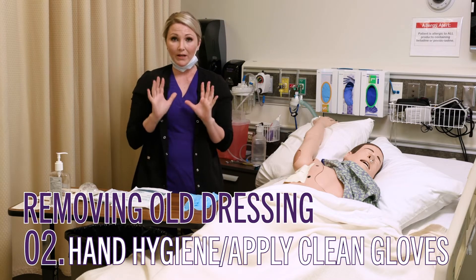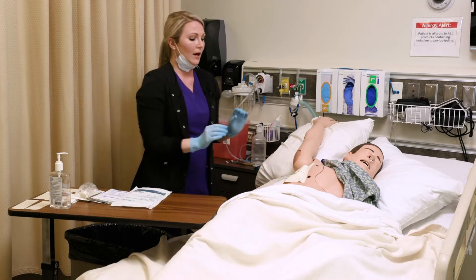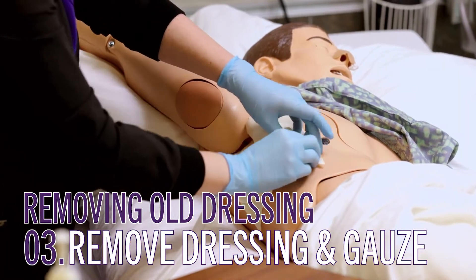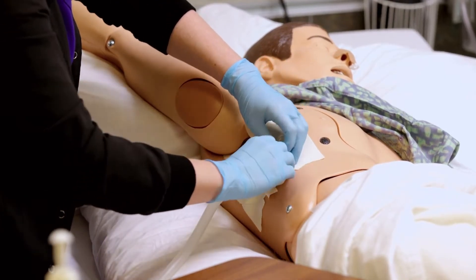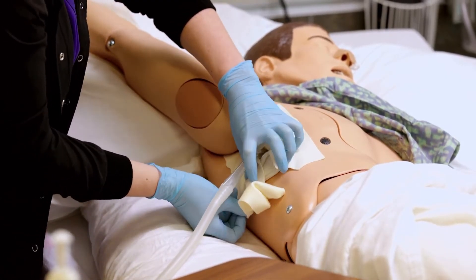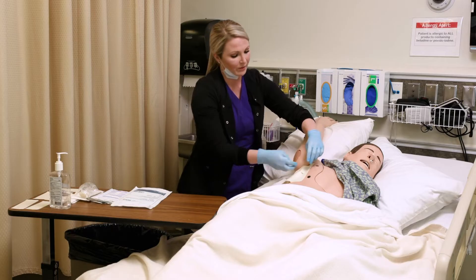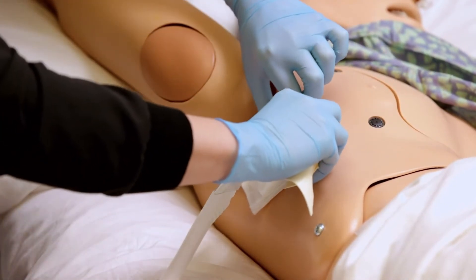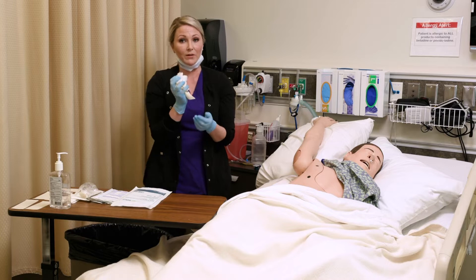I've already done hand hygiene. I'm going to apply clean gloves and then go ahead and remove the old dressing. I'm going to keep it as close to the patient as I can to eliminate pulling and unnecessary pain. Your chest tube is sutured into the patient, but we still want to be very cognizant that we are not pulling or tugging on that chest tube. Then we're gathering the gauze, removing that, and discarding it in the appropriate receptacle.